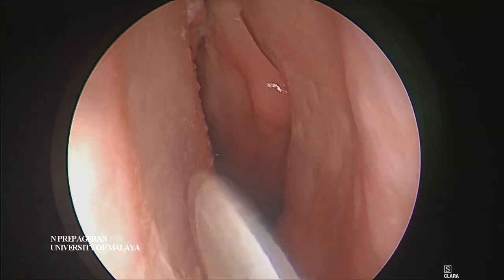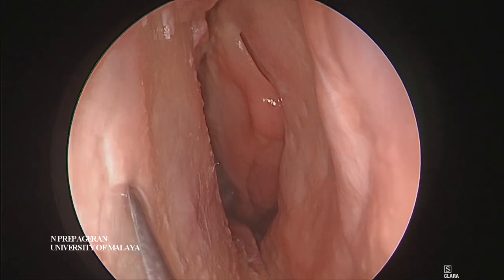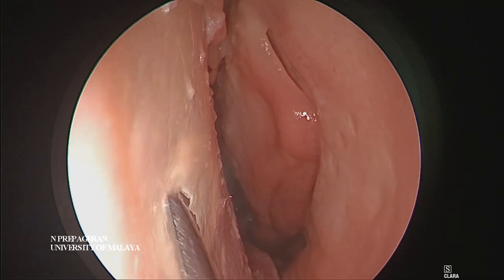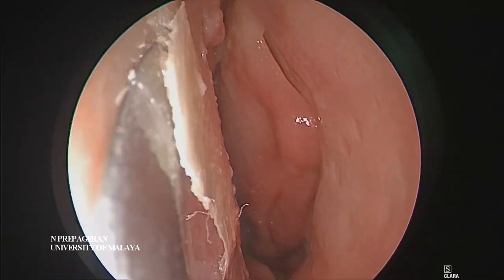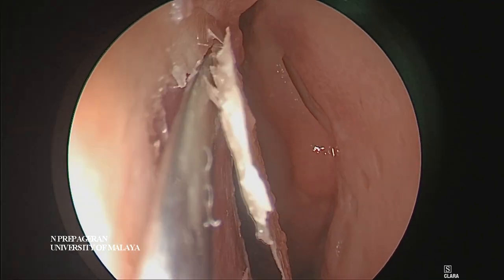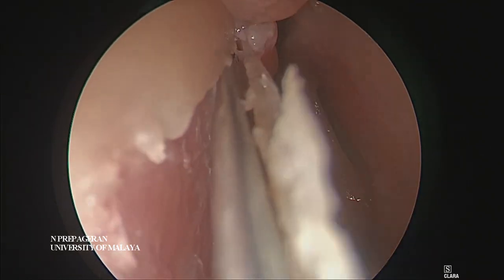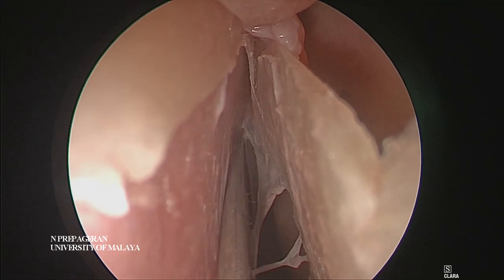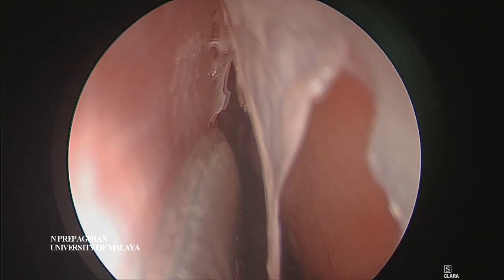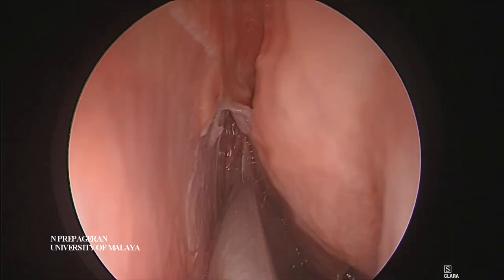Once we have done that we can correct the septum. This is the nasal valve region - if you want a proper airway you must make sure the nasal valve region has got maximum opening. We'll assume we've infiltrated the septum. Now we need to dissect and elevate the septum from the mucopericondrium from the opposite side as well.